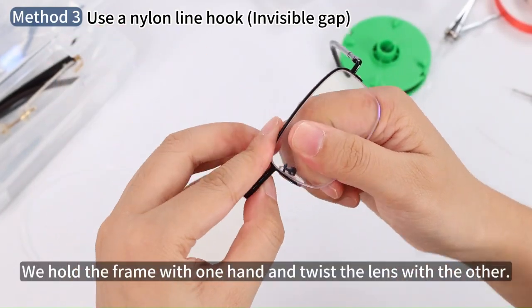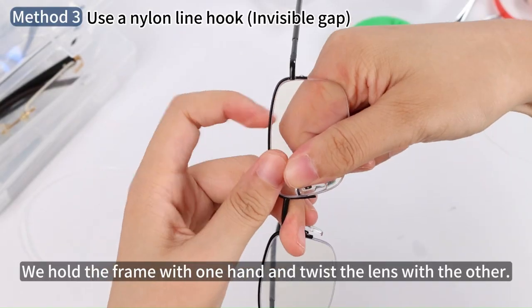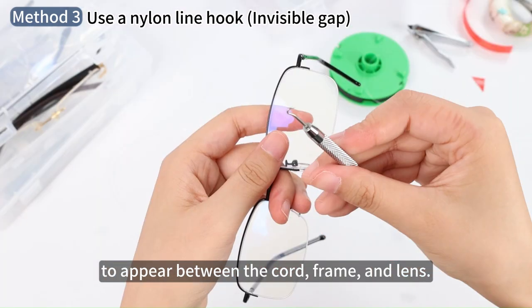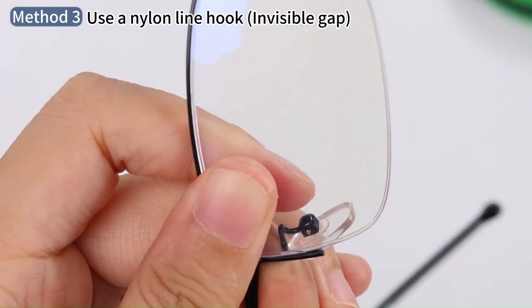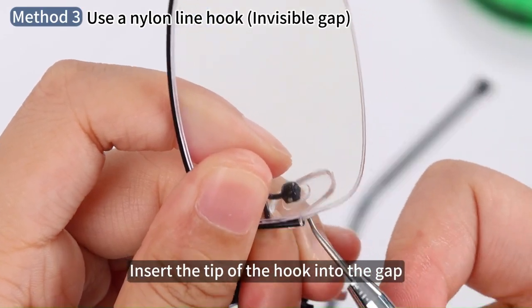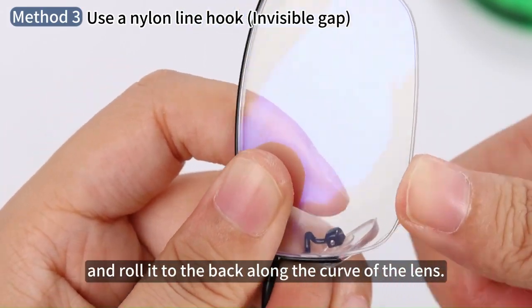We hold the frame with one hand and twist the lens with the other. Twisting will create a small gap between the cord, frame, and lens. Insert the tip of the hook into the gap and roll it to the back along the curve of the lens.